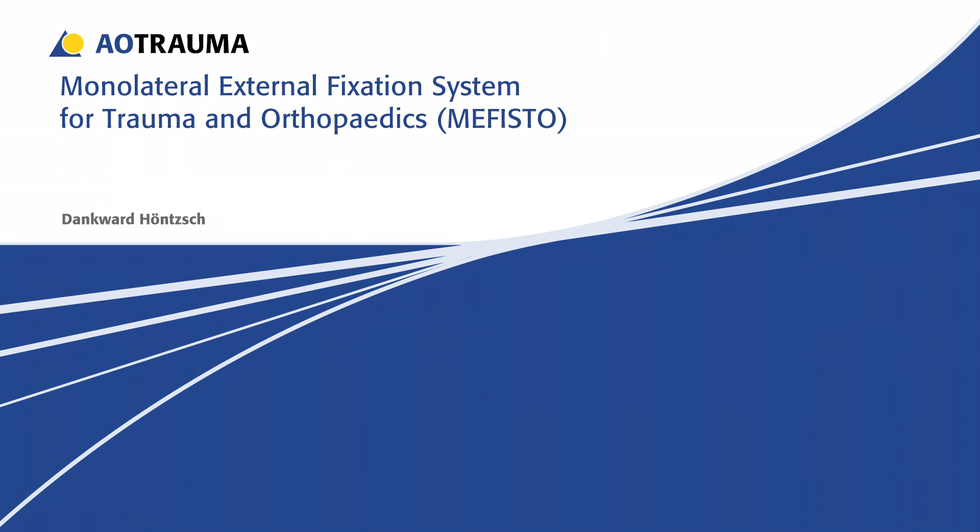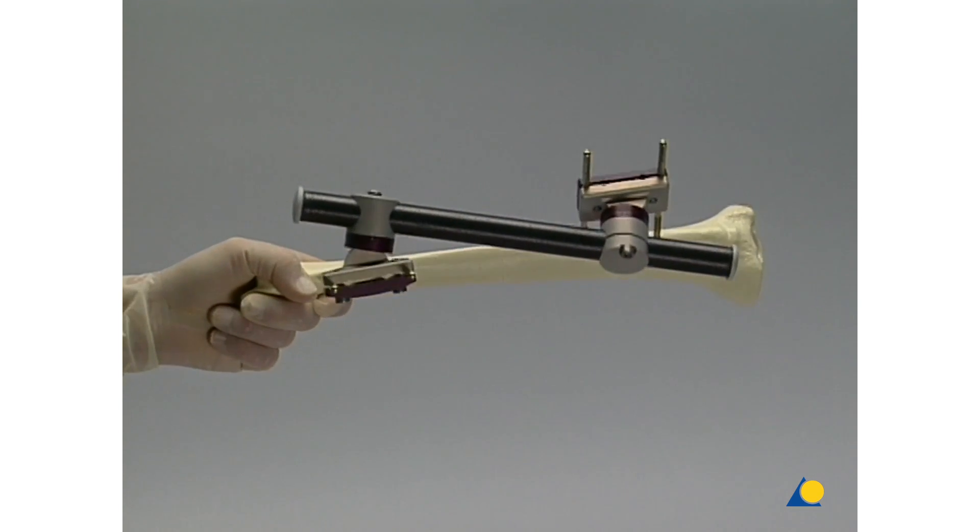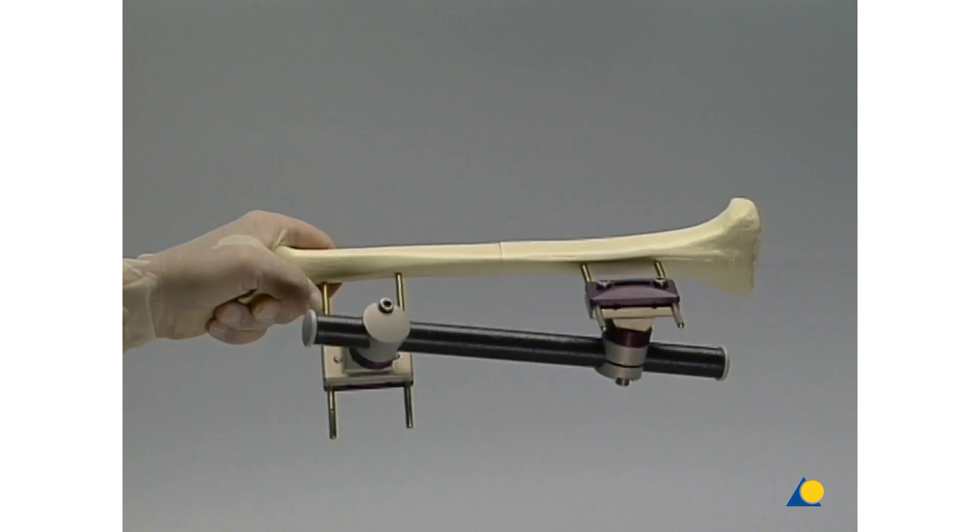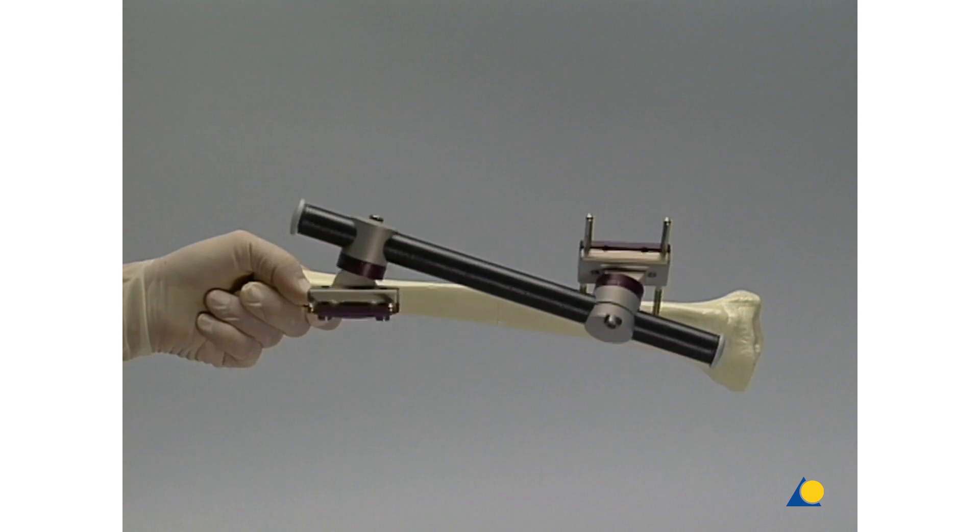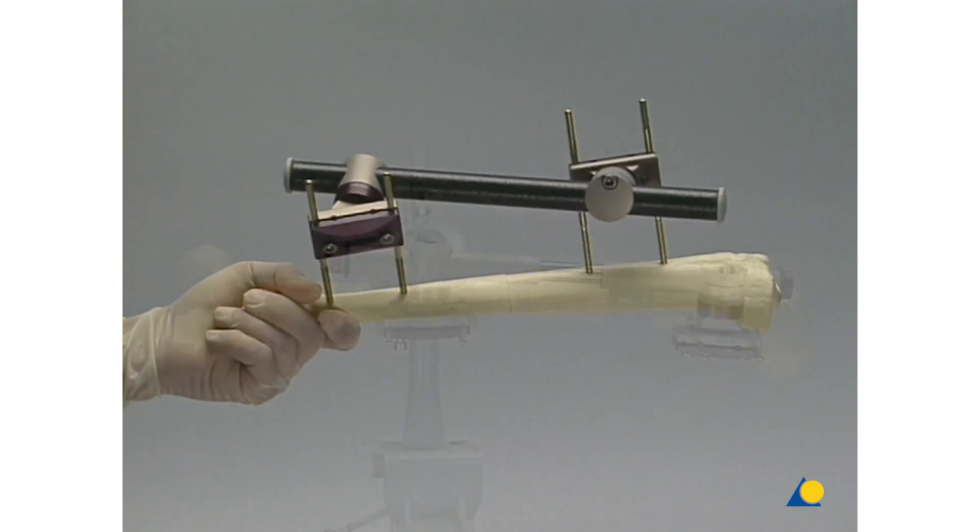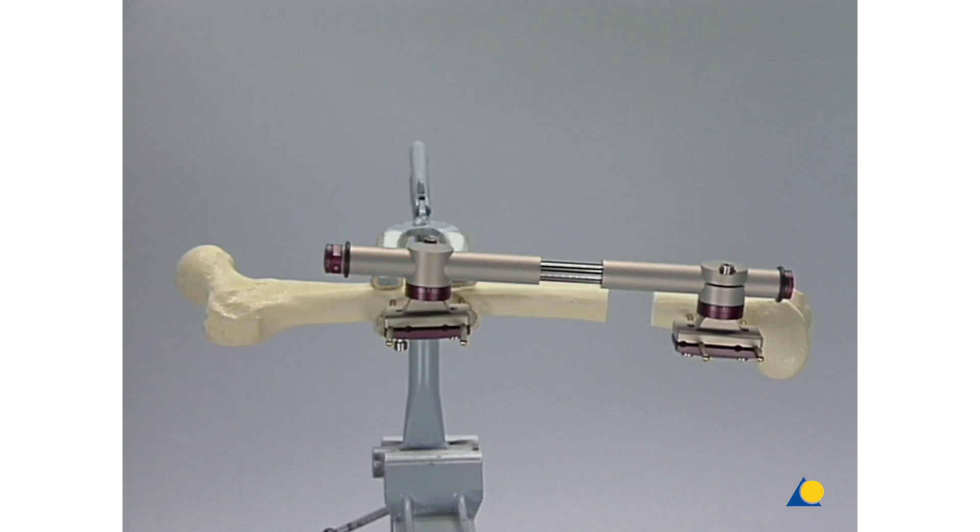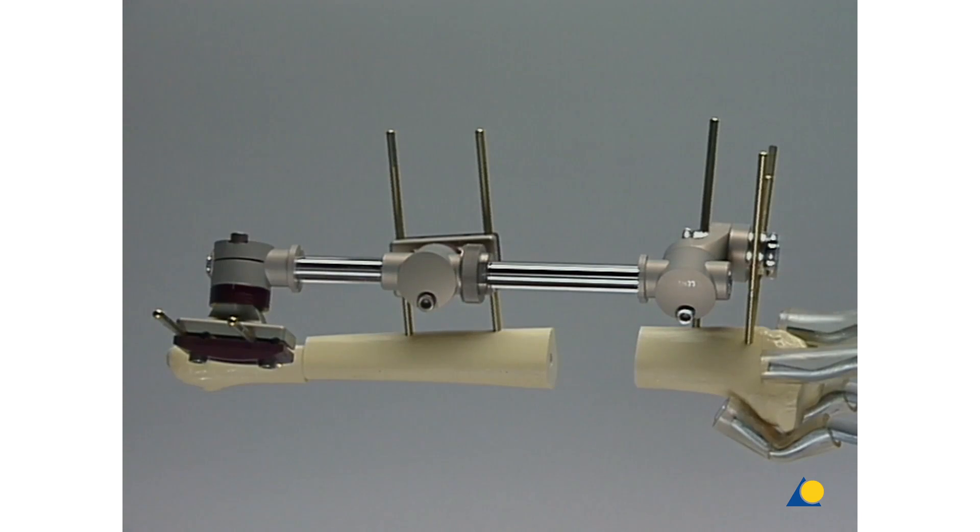The monolateral external fixation system for trauma and orthopedics, in short, Mephisto. Mephisto can be used for fractures and injuries of the entire musculoskeletal system and complex indications in reconstructive and orthopedic surgery, such as bone lengthening, segment transport, and angulation.